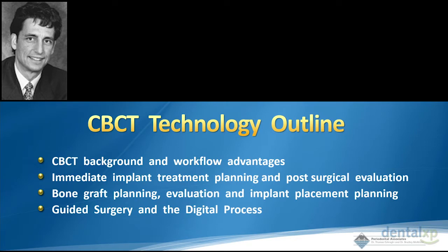Then we'll chat about bone graft surgeries, how we use CBCT both for pre-treatment planning, but also for the assessment of how successful we are with these new bone graft materials. Danny showed it nicely. He showed 100 different bone grafts on there. And so what you need to do is carefully evaluate what you are doing on a day-to-day basis, your hands, your materials. And the only way you can be effective is if you are looking at a CBCT data point.